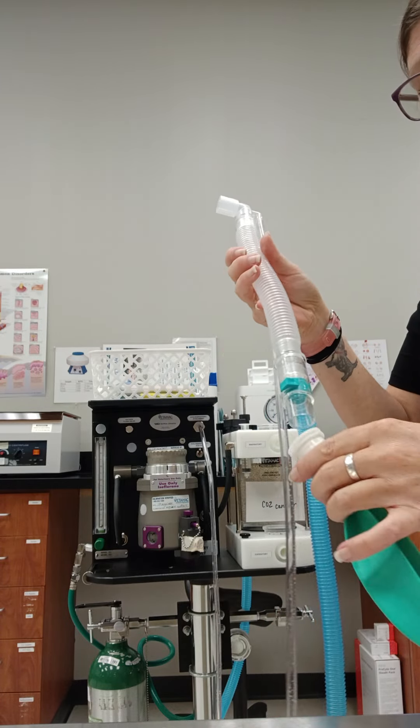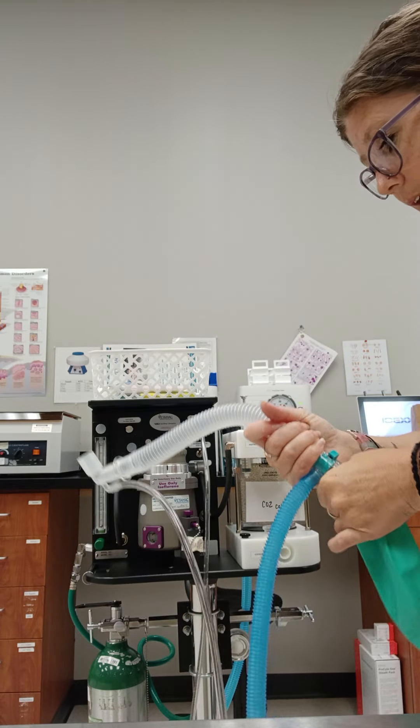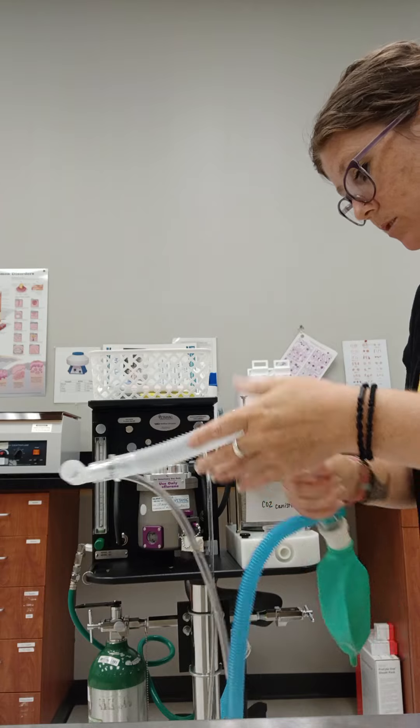With our straight system, we're just going to attach our reservoir bag to the end here. And we're going to do a quick leak test on this machine as well.